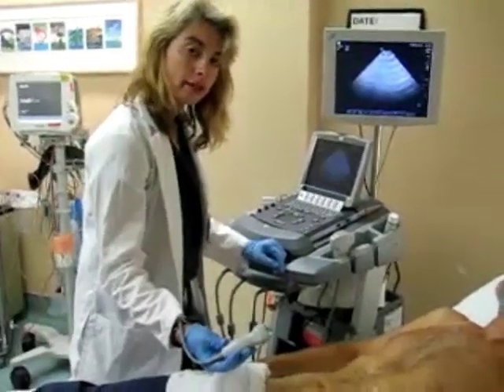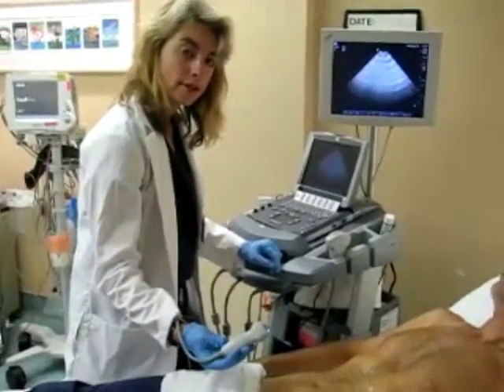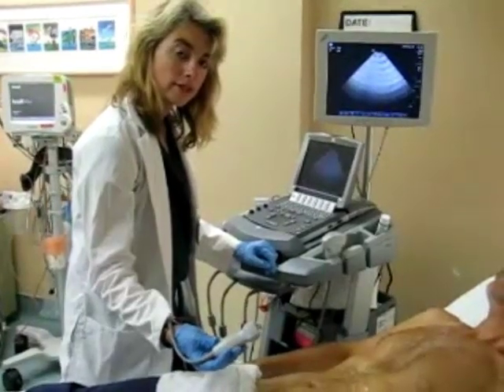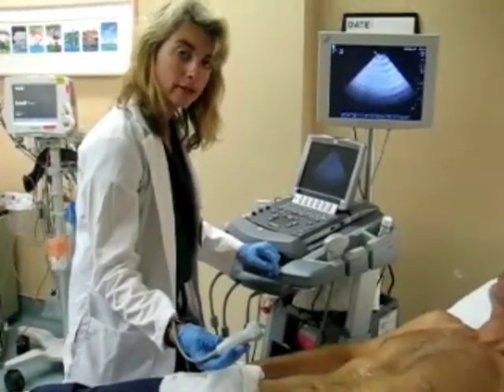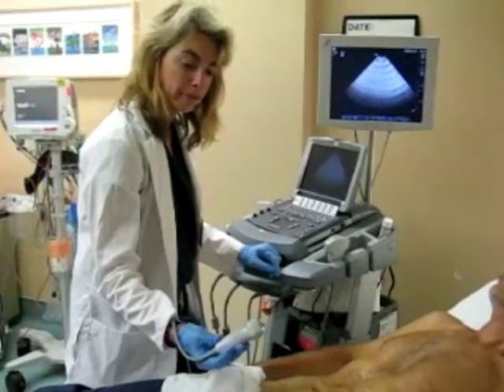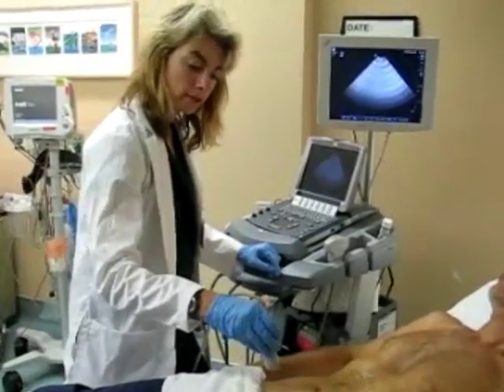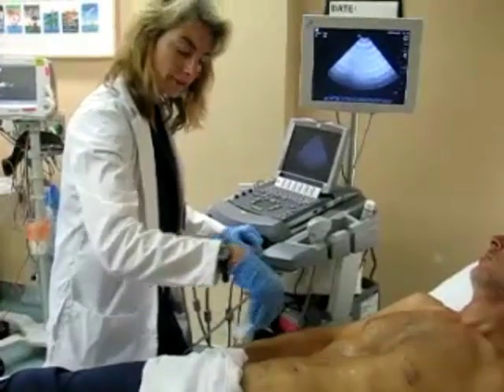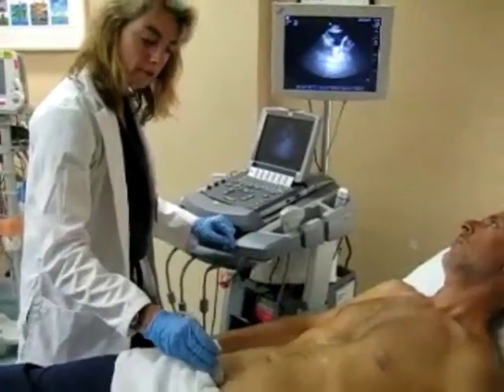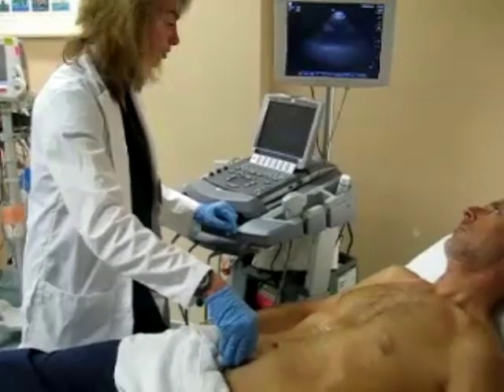The fourth view in the rapid assessment of trauma patients is the view into the pelvis. This interrogates the area around the bladder to evaluate for free fluid. The most common mistake is that people do not point the probe down enough towards the feet. The probe should be placed on the anterior abdomen and then aimed down towards the feet.